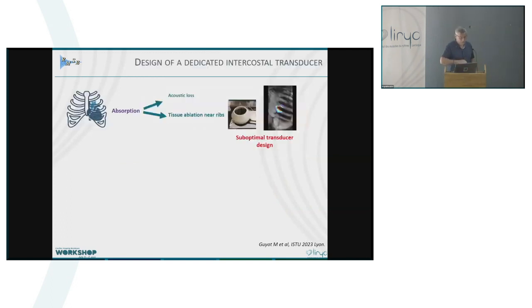With the same idea I said before, we show that we have the feasibility for stimulating the heart, but we could also try to do ablation. The issue is that with a conventional large-scale emitter designed to send high-power ultrasound pulses, you intercept the bones from the costal grid, and these ribs absorb a lot of the ultrasound wave, and then they retrodiffuse the heat to the surrounding tissue.